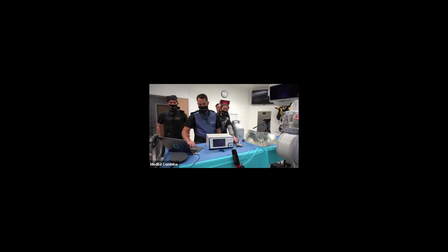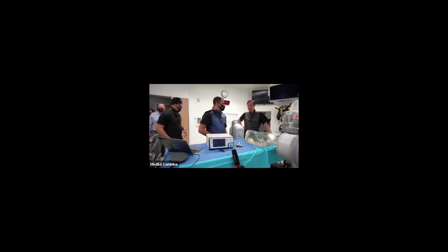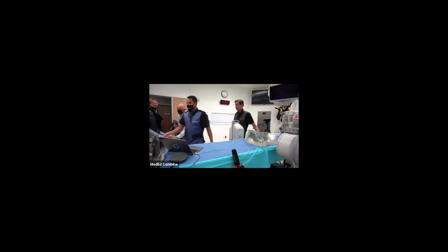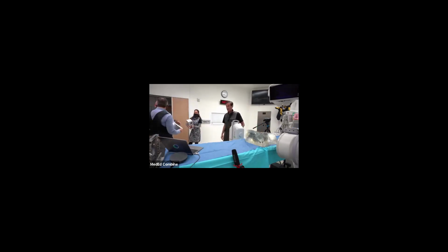Go ahead. Adrian wants to know, how do you trial this? You don't. You don't need to trial. Everybody that I do this on, I do an anesthetic discogram, and they have to be concordant. So I do test first, usually with anesthetic discography. You don't have to. I do in some patients, just to be more sure we're going for the right thing and the patient gets relief.